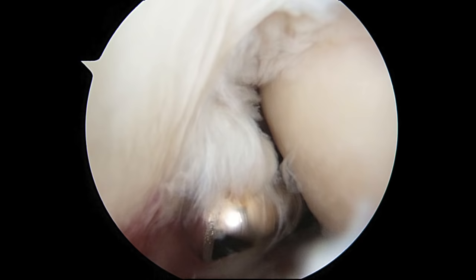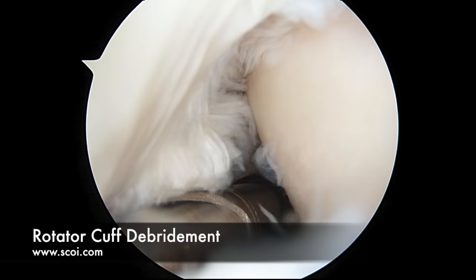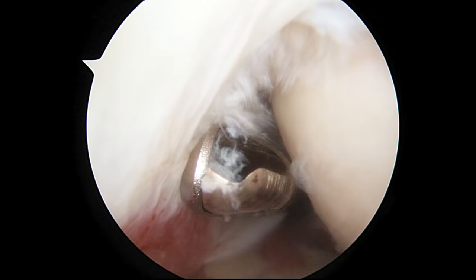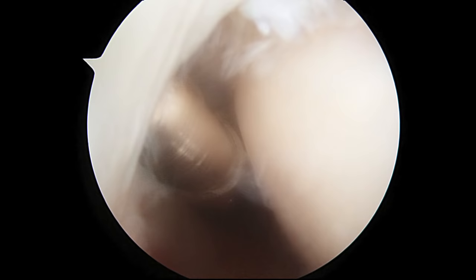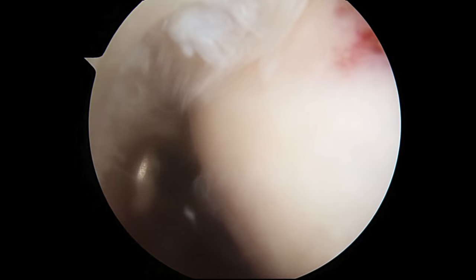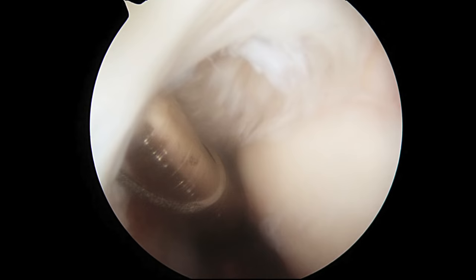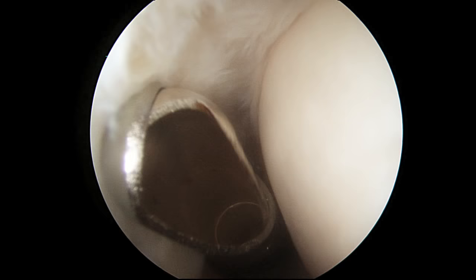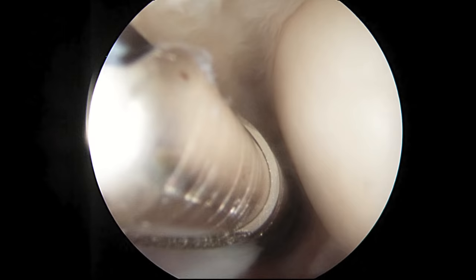The next step is to do a rotator cuff debridement. We have a small 5.5mm shaver that we can insert through an anterior cannula and start to very carefully debride away the damaged tissue of the rotator cuff and get down to what is intact tendon. There are intact fibers above this rotator cuff. As we debride the torn fragments, we can see intact fibers underneath — right there. So that is a good sign. We are starting to clean this up.